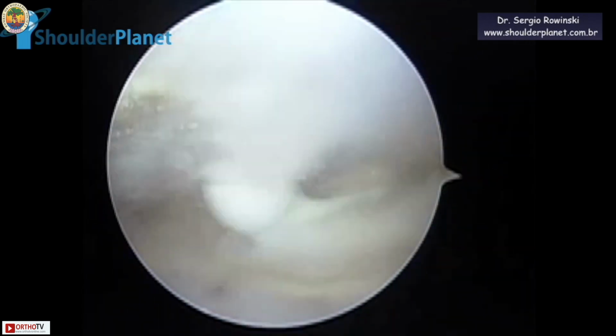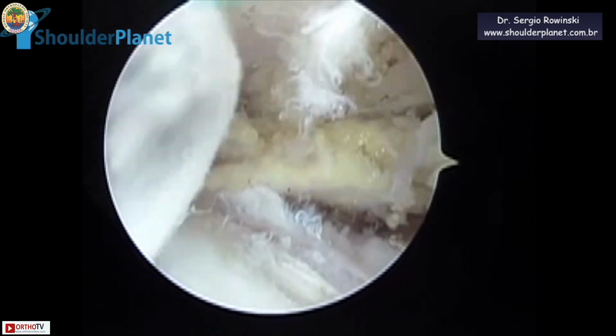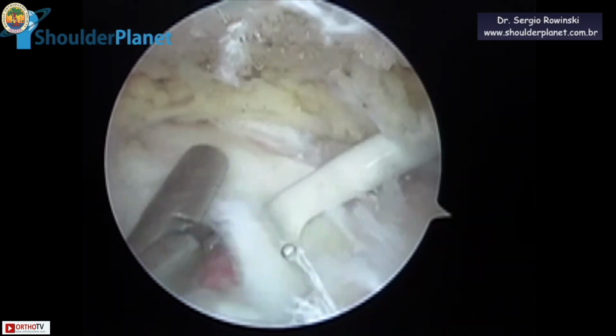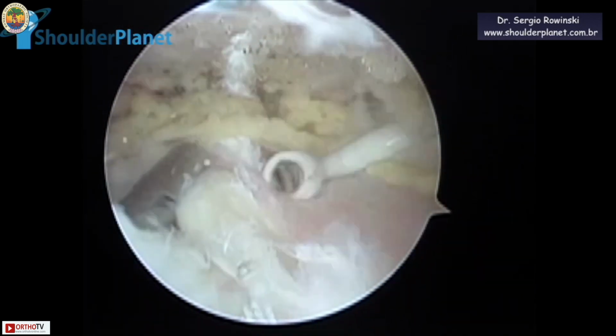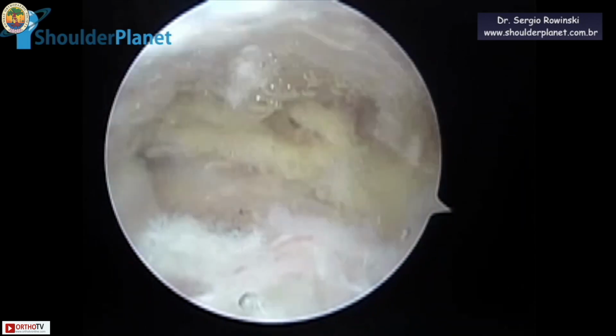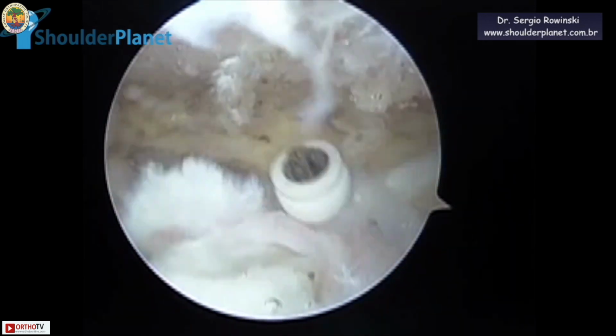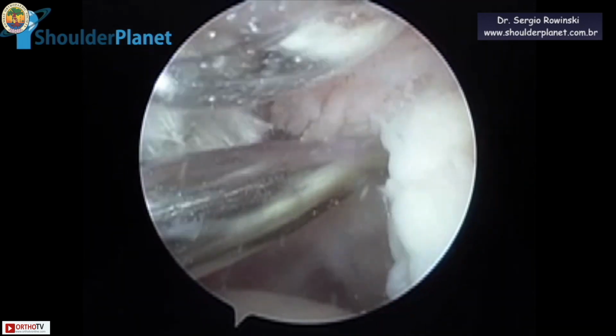We released all the adhesions between the cuff and the distal clavicle, and then we reassessed the tendon mobility, and we can even grasp the tendon as we are seeing now to have a better debridement of all the adherences.